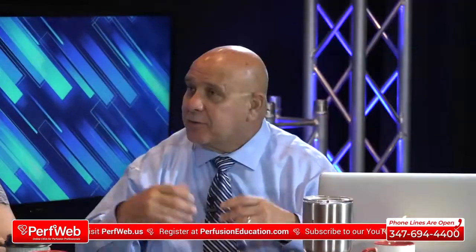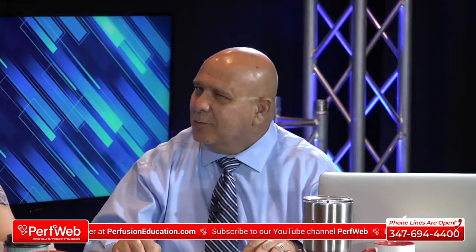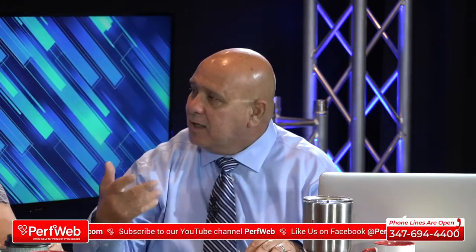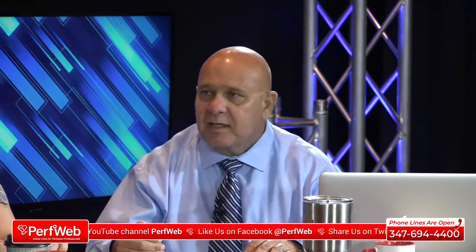Ideal, on the ideal patient, the patient who is not moving, the patient who has a normal cardiac rhythm, who doesn't have atherosclerotic peripheral vascular disease, which is none of our patients. There are so many confounding factors.